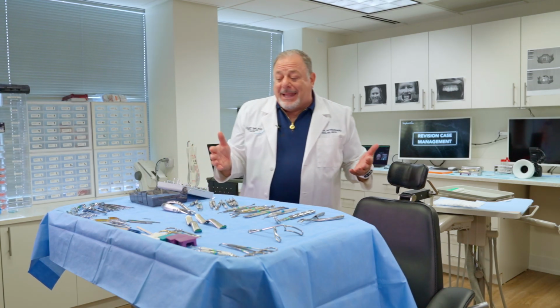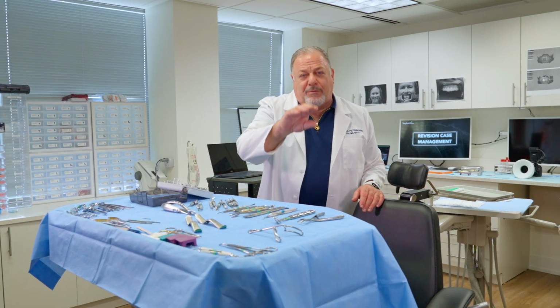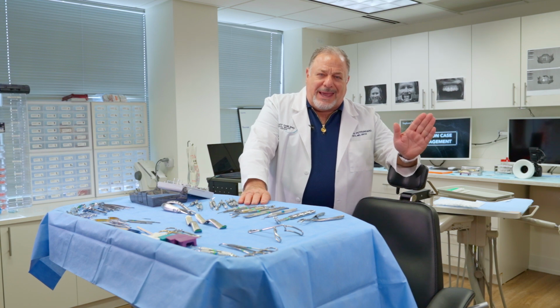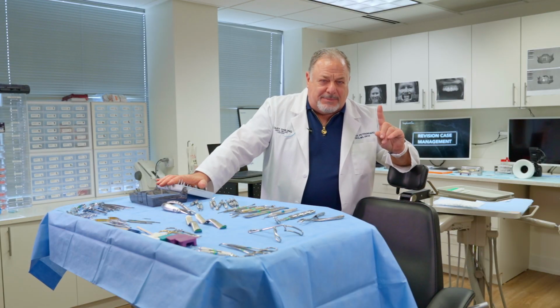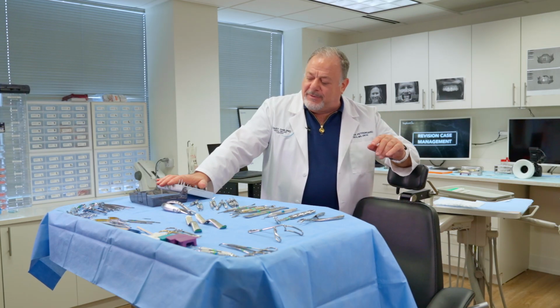And then we're going to plan on using a replacement of the zirconia implant with another, because the one we're removing now is a fractured zirconia implant, not a system that I use, that has a carbon screw, which is some of the fracture problem with it and the removal of it, which we'll go through in the case. So when we remove this failed zirconia implant, it's cosmetically failed, not the material, not a fracture of the material. The implant was placed improperly, which I'll show you as we go through the video.